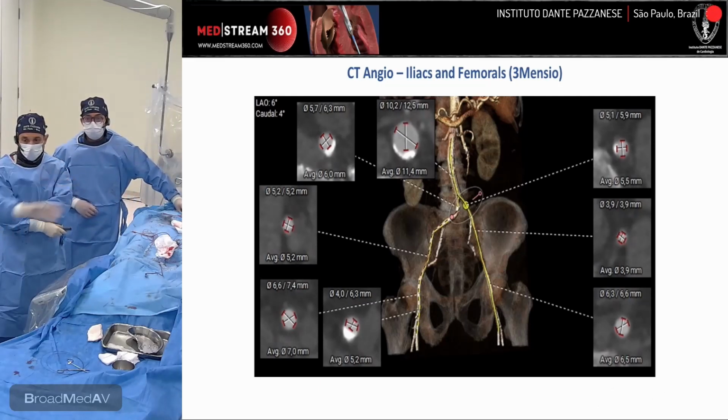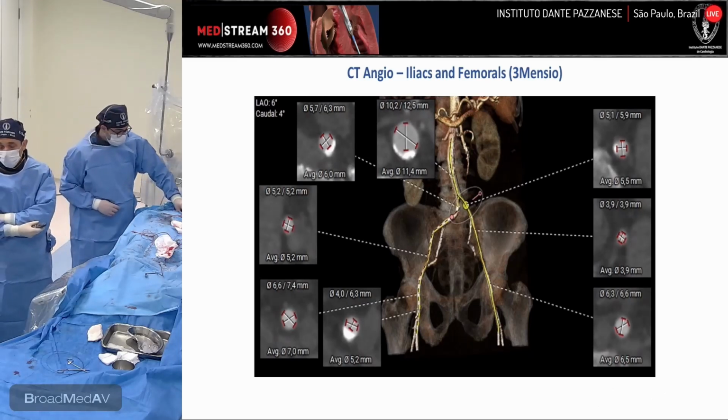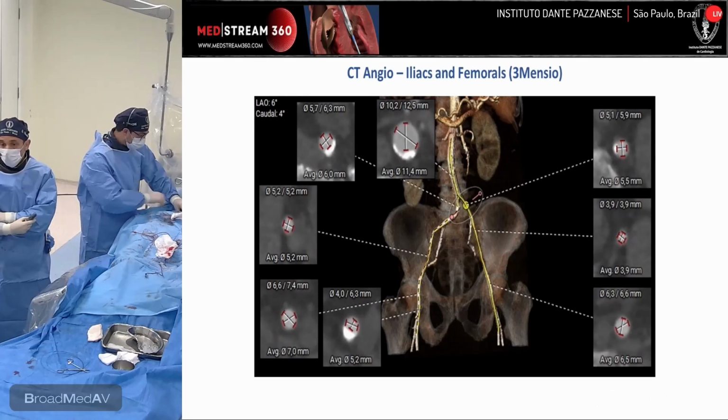So, Dimitri, can you make comments about this image? I think it's very important, with what you have there in Alberto's hands now doing the compression. Yes, like we said before, it's a challenging anatomy because of small diameters, but we think we performed all the preventable steps with ultrasound guided puncture, and we used an expandable sheath, and we protect the vessel.